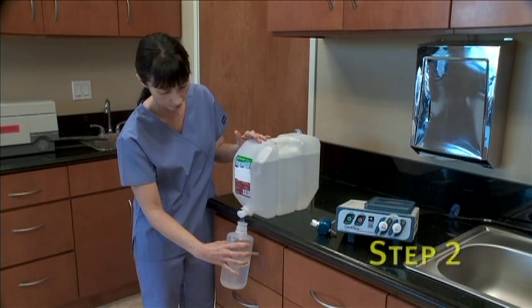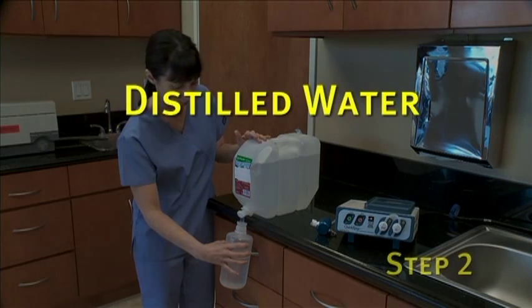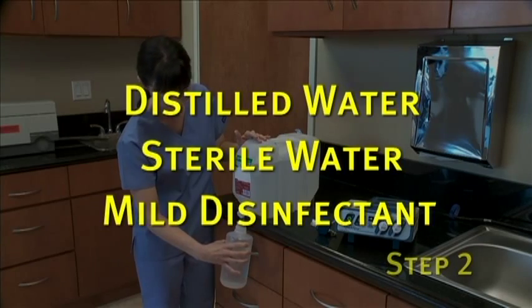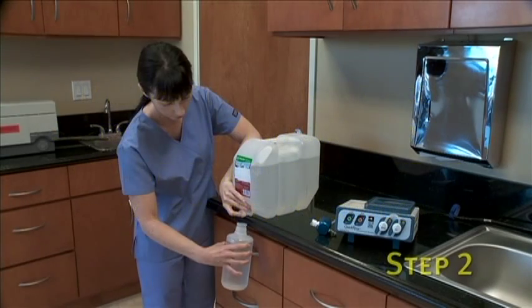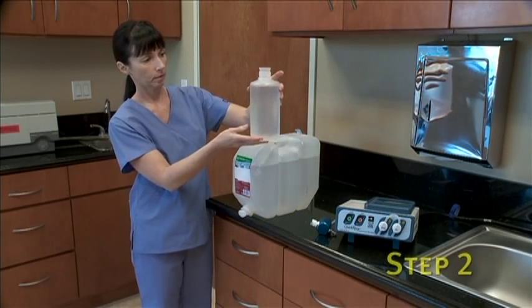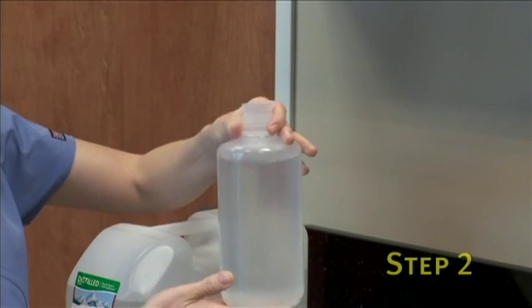For the second step, we are going to fill and connect the rinse fluid container. The most common fluid used is distilled water, but sterile water or even fluid with a mild disinfectant can be used as well. It is best to check with your supervisor or infection control committee to determine what is your facility's protocol. First, fill the container with either sterile or distilled water, making sure to leave one inch of space from the bottom of the bottleneck.